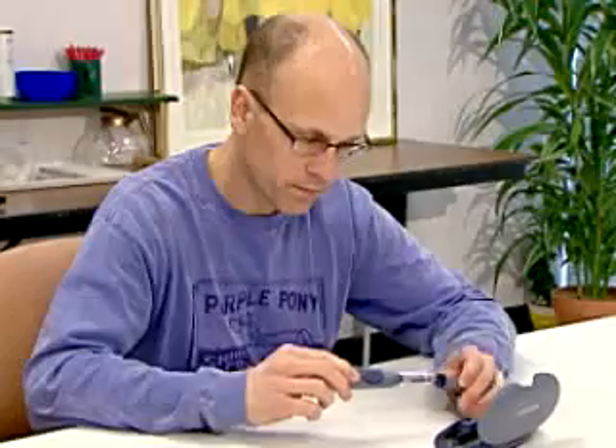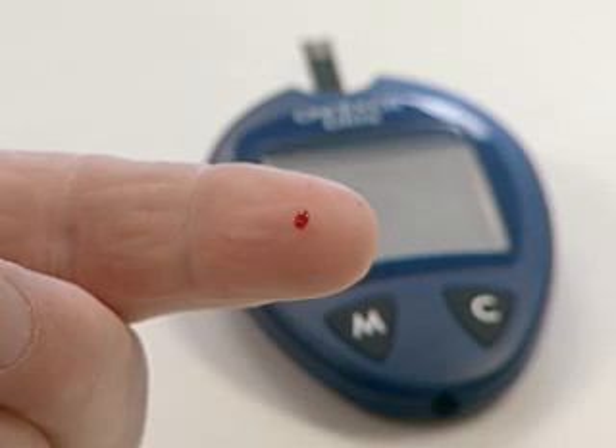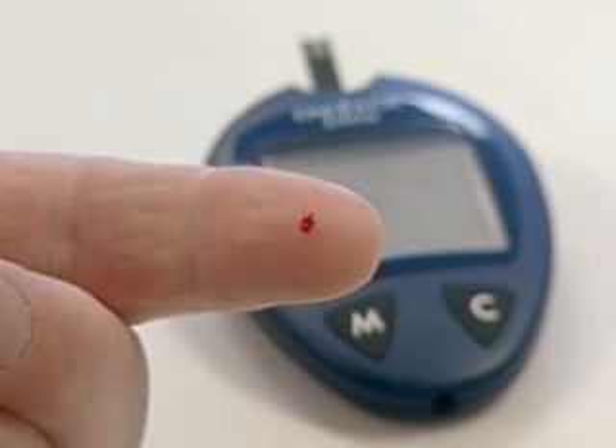Rapid changes can occur after a meal, after taking insulin, during exercise, or when you're ill or under stress. During these times, you should use blood from a finger stick. You should also use fingertip blood if you think your blood glucose is low, if you don't usually have symptoms when your blood glucose is low, or if the result from the alternative site doesn't match how you feel.